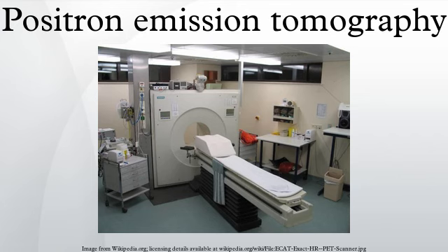In practice, since the brain is normally a rapid user of glucose, and since brain pathologies such as Alzheimer's disease greatly decrease brain metabolism of both glucose and oxygen in tandem, standard FDG-PET of the brain, which measures regional glucose use, may also be successfully used to differentiate Alzheimer's disease from other dementing processes, and also to make early diagnosis of Alzheimer's disease. The advantage of FDG-PET for these uses is its much wider availability. PET imaging with FDG can also be used for localization of seizure focus. A seizure focus will appear as hypometabolic during an interictal scan.